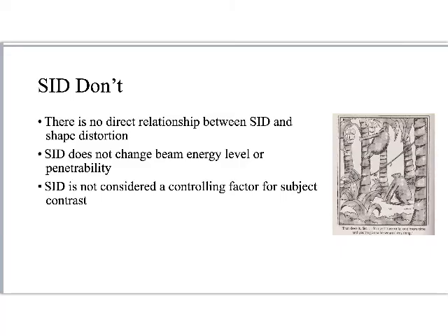Some stuff that SID doesn't do. There is no direct relationship between SID and shape distortion. It doesn't affect it. Okay? SID does not change beam energy level or penetrability. So let's drill down into those two because they're both important.